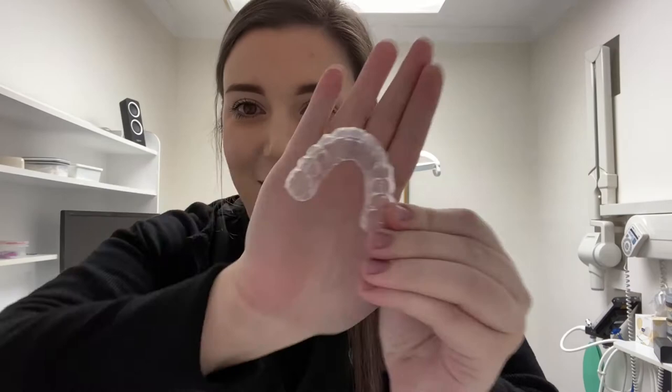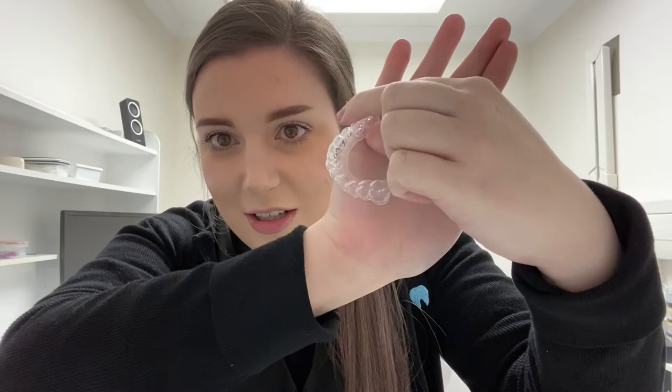For the lab to make those impressions into the actual whitening tray, it takes about one to two weeks. Jess's will take about one to two weeks, and then you can pick them up with the whole kit. This is what they look like once they're finished. You can't really see them because they're clear, but it's essentially my teeth in a clear formation. They sit in without the whitening gel — I'll just show you.